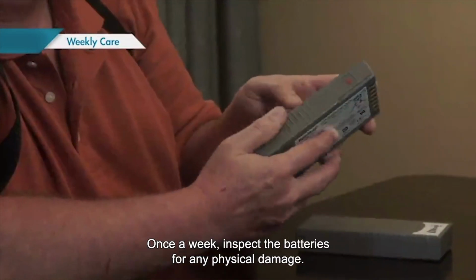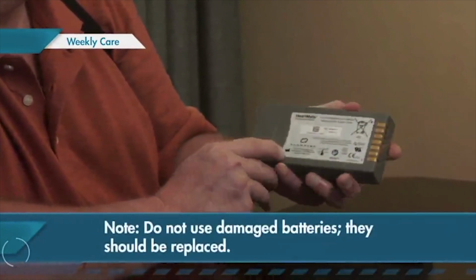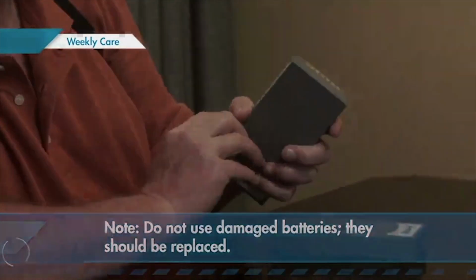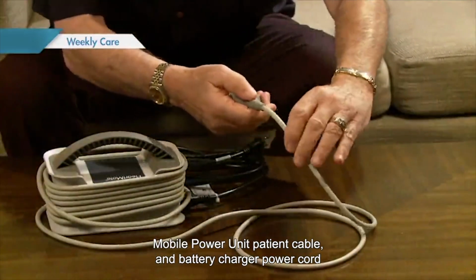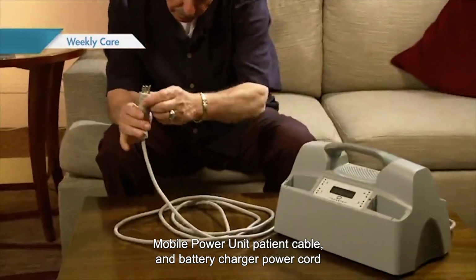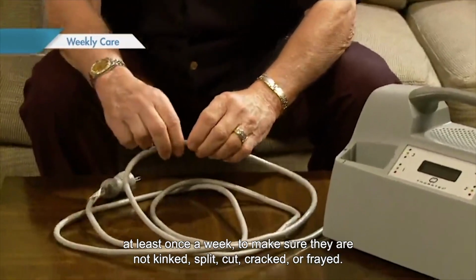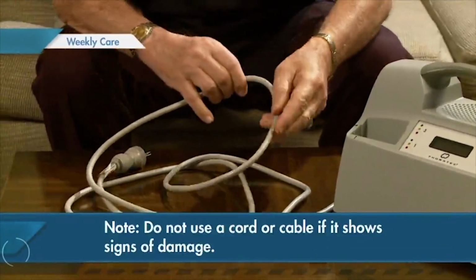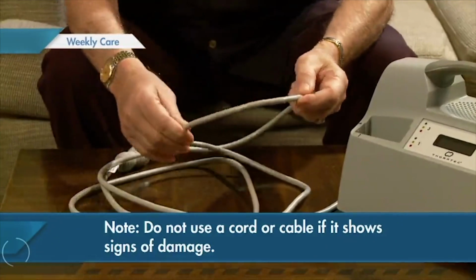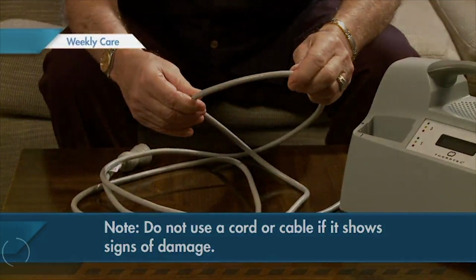Once a week, inspect the batteries for any physical damage. Do not use damaged batteries. They should be replaced. Inspect the mobile power unit power cord, mobile power unit patient cable, and battery charger power cord at least once a week to make sure they are not kinked, split, cut, cracked, or frayed. Do not use a cord or cable if it shows signs of damage. Obtain a replacement from your VAD coordinator or hospital contact person if needed.